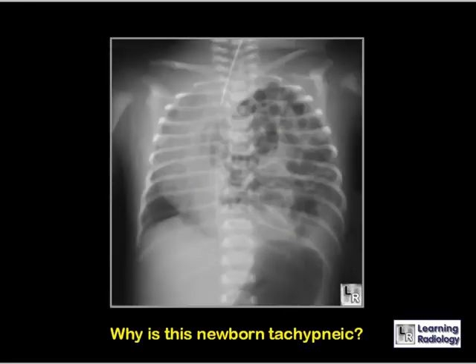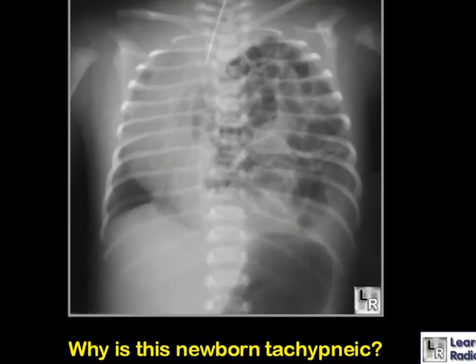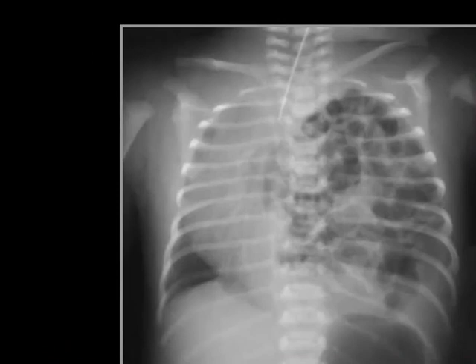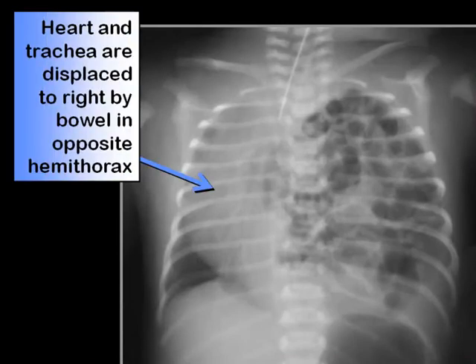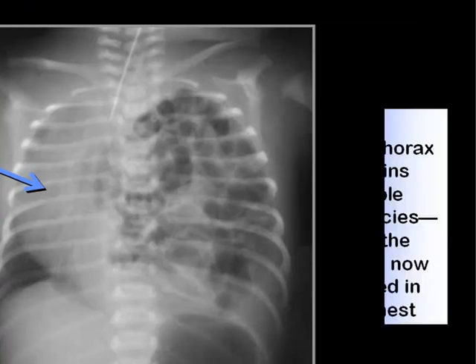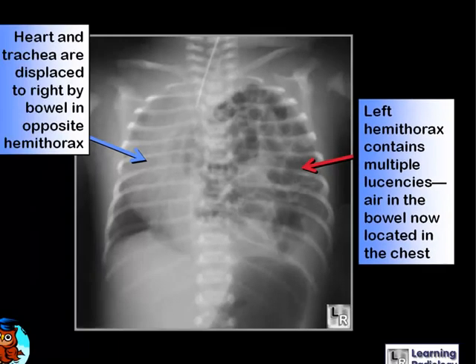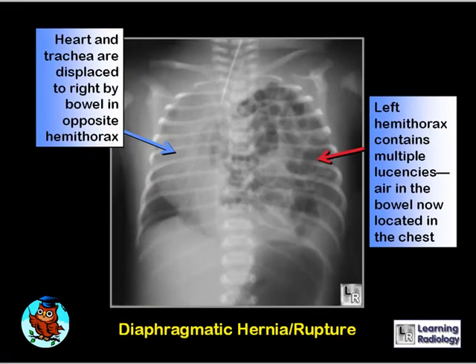Why is this newborn tachypneic? When looking at any image, ask: is it abnormal, and which side? Even though the heart and trachea are displaced to the right, the abnormality is on the left side — multiple lucencies representing air in loops of small bowel now located in the chest. This is characteristic of a diaphragmatic hernia, although it could represent congenital absence or rupture of the diaphragm.